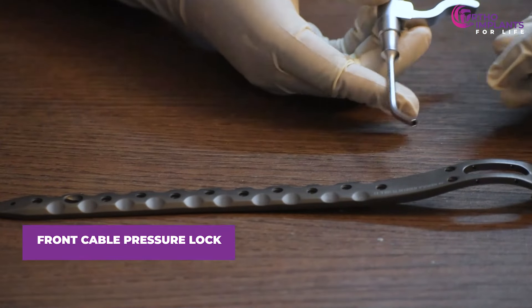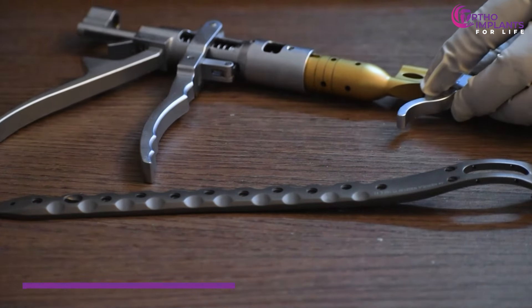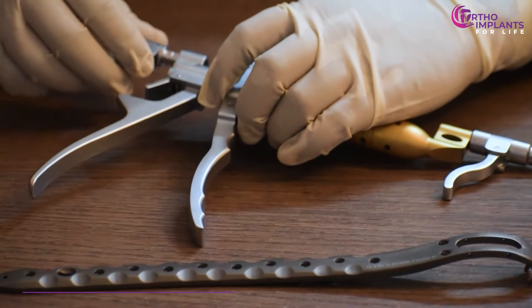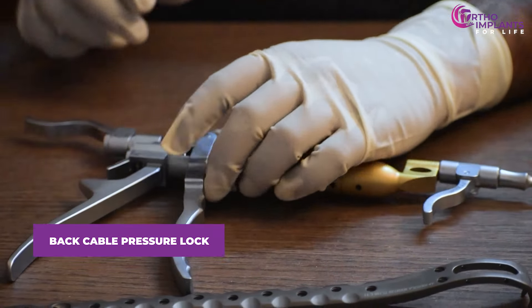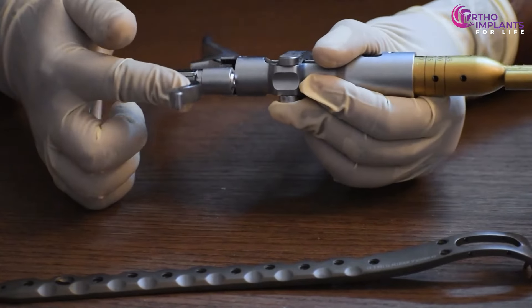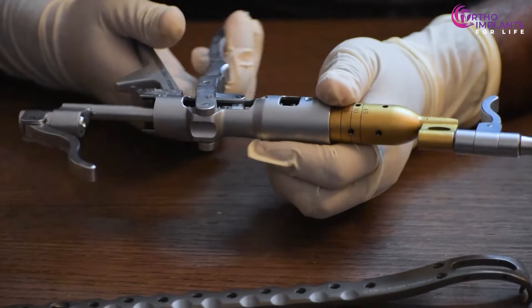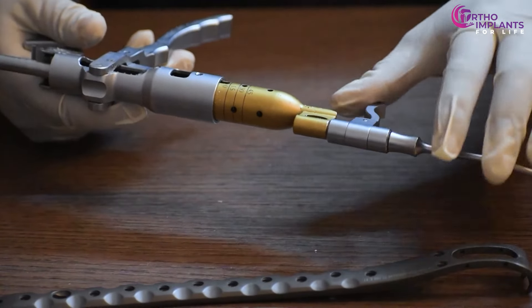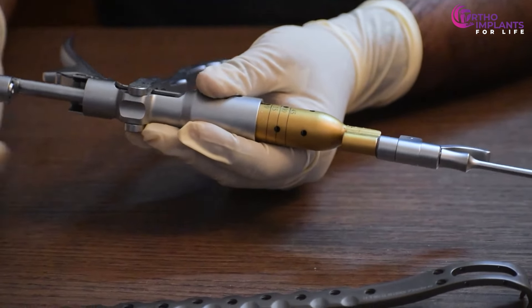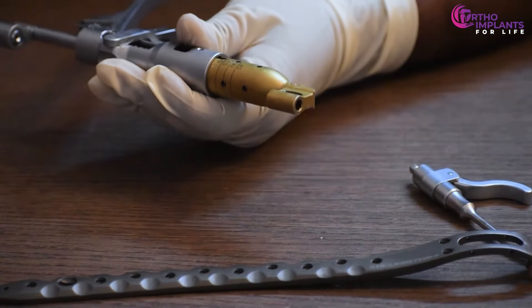In order to lock the cable, we will take the front cable pressure lock. Then we take the cable tightener tool and attach it to the front pressure lock. Then we attach the back pressure lock. Keeping the front pressure lock loose, we lock the back pressure lock and add compression to it. After applying compression, we lock the front pressure lock and remove the back pressure lock along with the cable tightener tool.